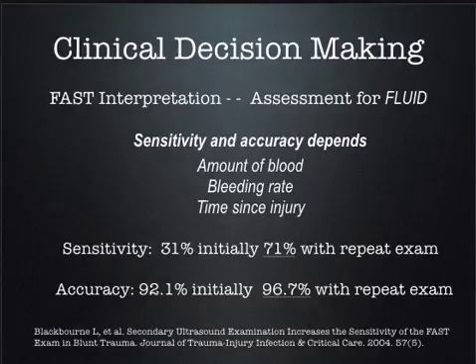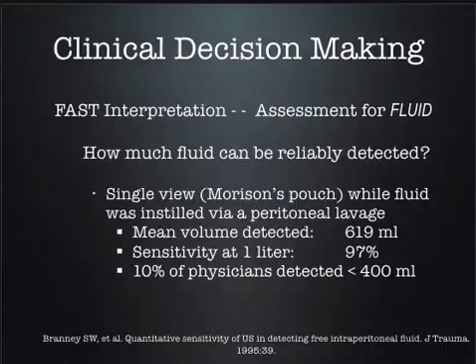How much blood does it take? Well, it turns out it takes a fair amount of blood before you can see it. People like Dan over there, me, Jed back there, who have been doing this for a while, can probably pick up maybe 400 cc's of blood. Okay, is 400 cc's of blood a lot of blood?